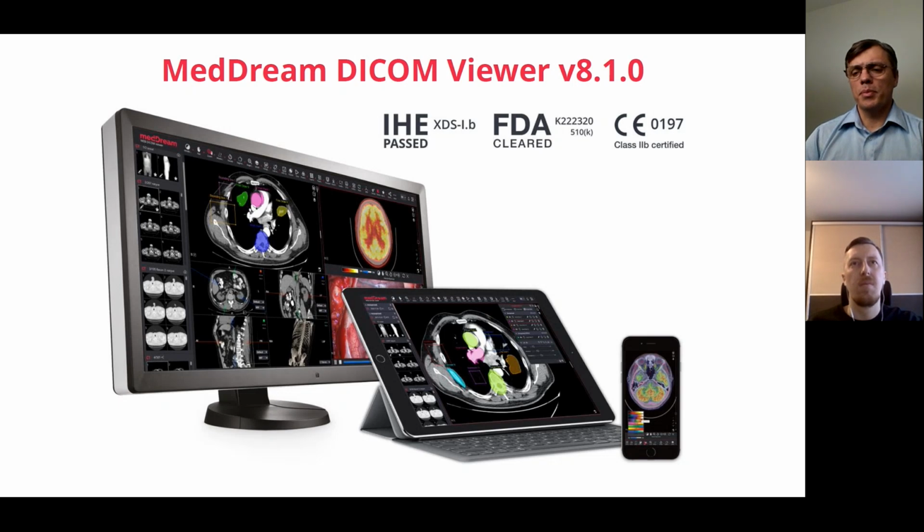I'd also like to express that this version is the first version natively integrated with Amazon and Microsoft medical services, and I'm proud to say that you're also seeing our next technical training speaker, Marius, online. I really propose you check our website and see our upcoming technical trainings, where Marius will have the occasion to train you together with Microsoft people about the new possibilities this version gives you. This webinar will come in a few weeks, and I really recommend you not to miss it.